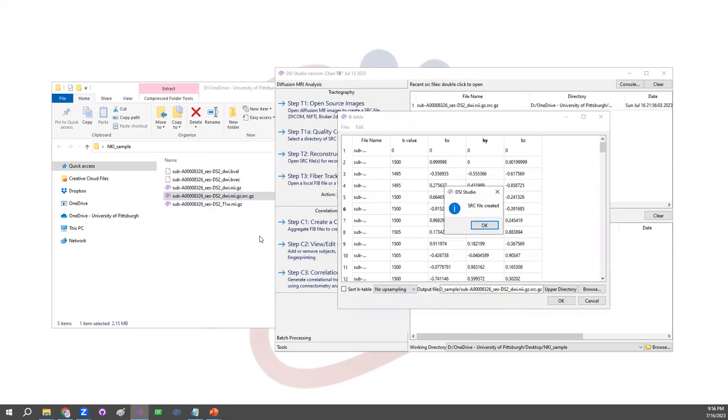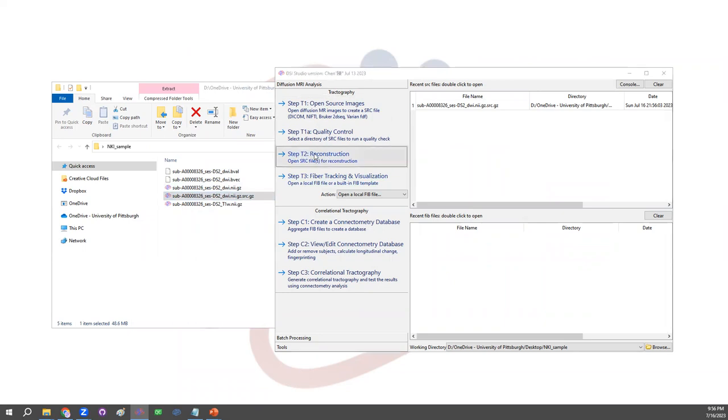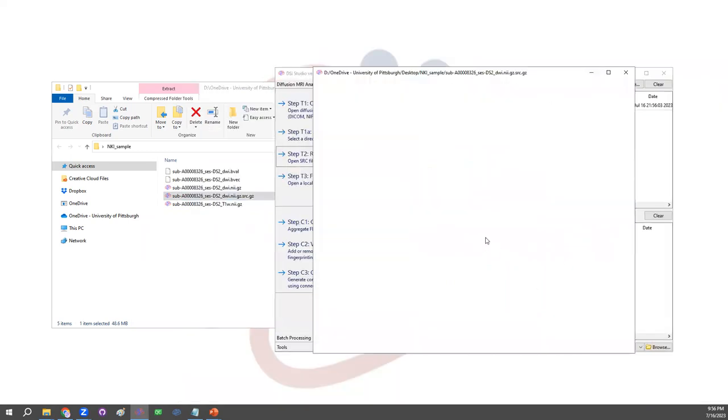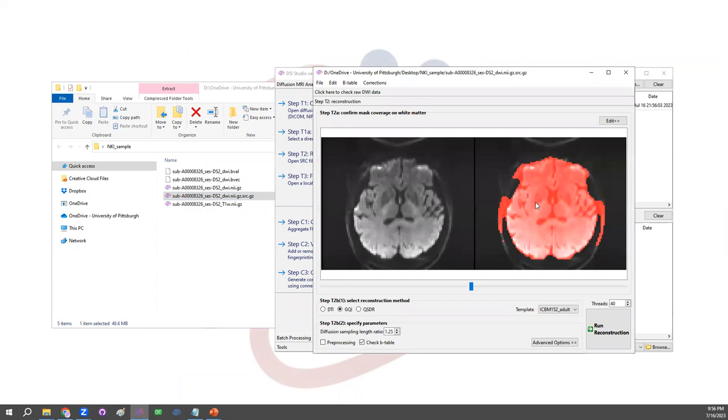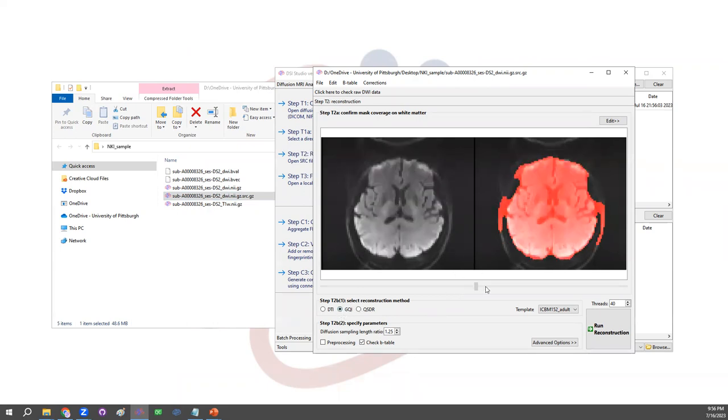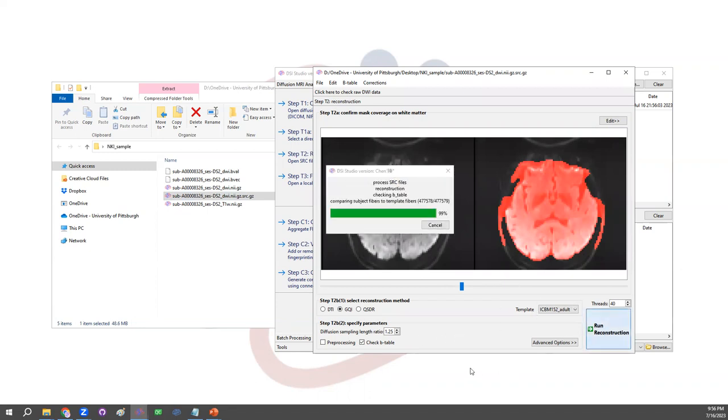And there are also commands available to do this for processing a large amount of subject data. Now having this data, we'll go straight to the step T2 reconstruction. Open the file we just generated, the src.gz file. And here DSI Studio is going to present a brain mask. For the method GQI we're going to use for resolving fiber, the mask is not really important. Even though it's not a perfect match with the brain contour, it doesn't matter.